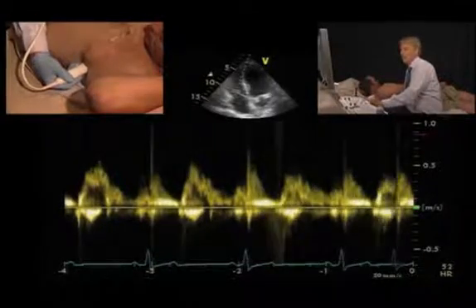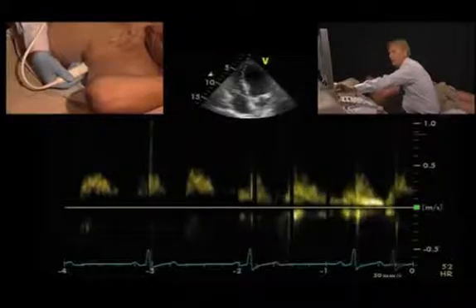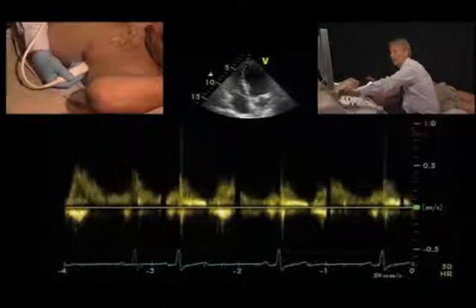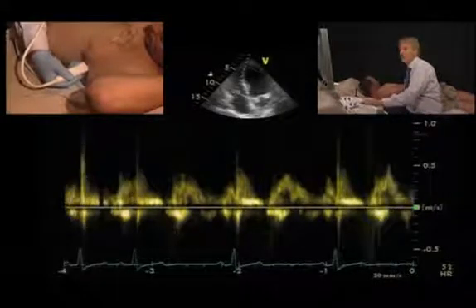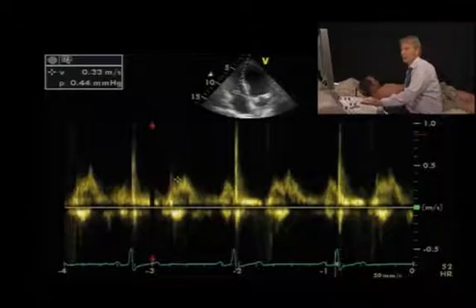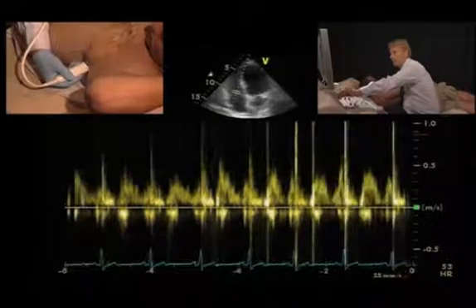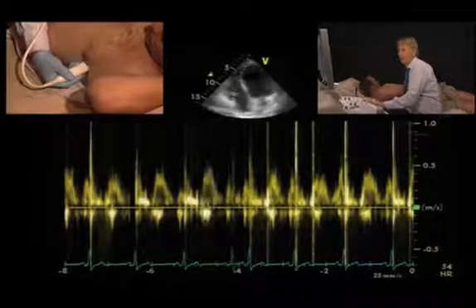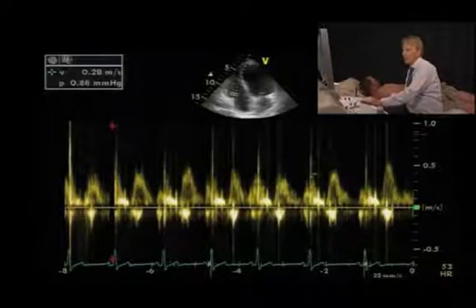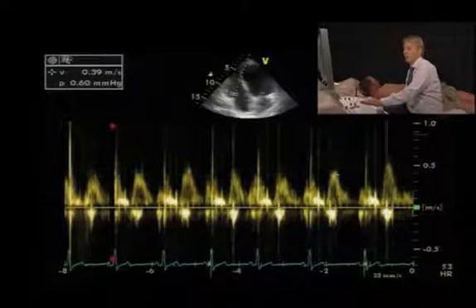Optimize the settings: don't put the filter too high because you have low velocities — reduce the filter setting and optimize your velocity range, since the velocity across the tricuspid valve is lower. What you get is an E wave and an A wave very similar to the mitral valve. With an extended time scale you can see fluctuations in the velocity of the E wave — the inspiratory inflow of the tricuspid valve is higher than the preceding beat.